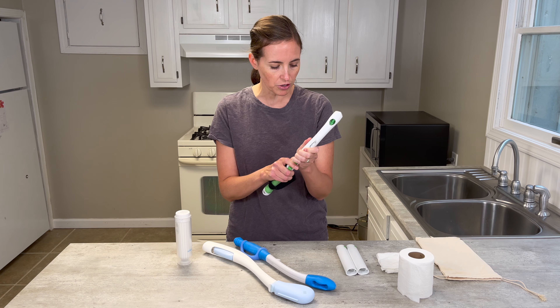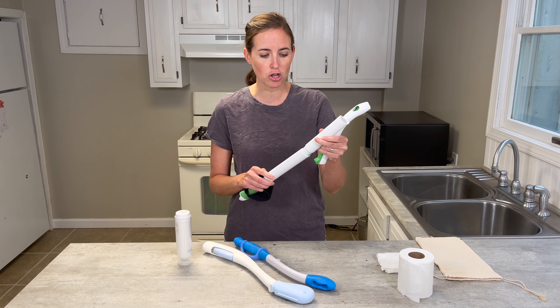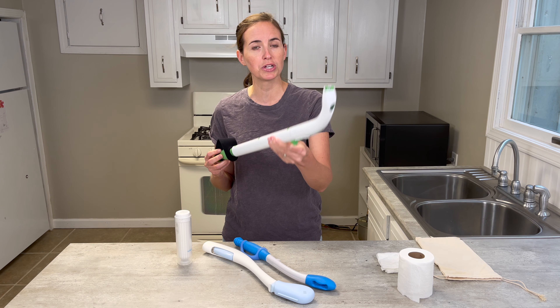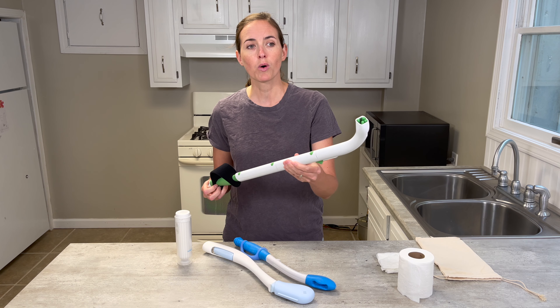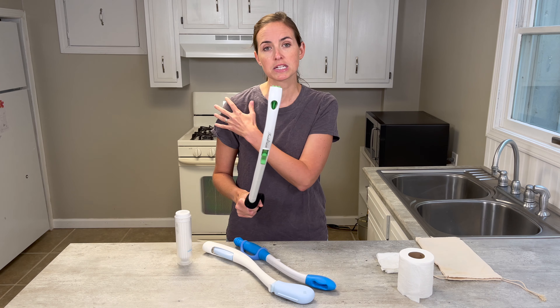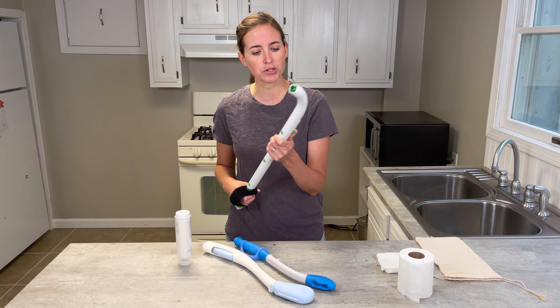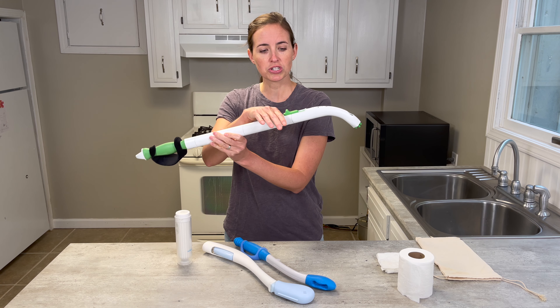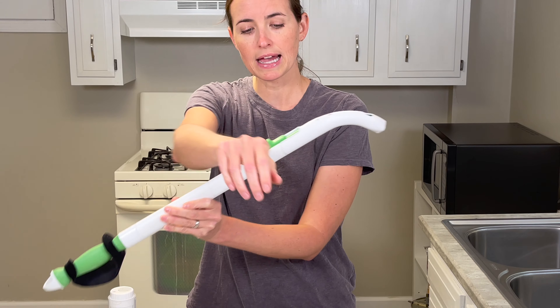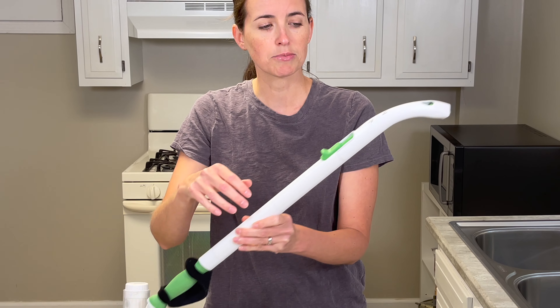It comes with various extensions, which I think is really important. These extensions allow you to make this the longest option for a wiping aid, which matters because some folks will be reaching from significantly farther away — whether because you're doing it from a laying or reclining position, or perhaps you have very limited shoulder movement. The lever is designed to be very easy to function with; I can push it with my hand, my finger, or even my forearm. So if you struggle with dexterity, this is a decent option.